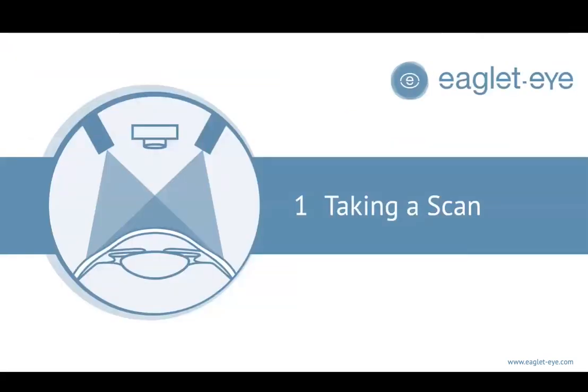Now, when we take a scan, this is where we'll slow things down just a little bit. The scan process requires several key steps, and the key to success really is that operators have to remain focused on the guidelines of how to take measurements. I think of this like, follow the fitting guide.